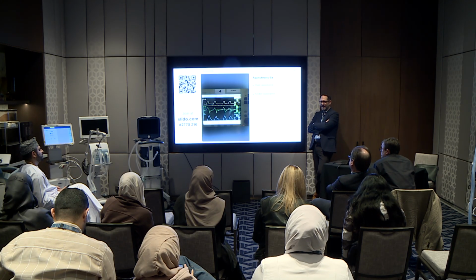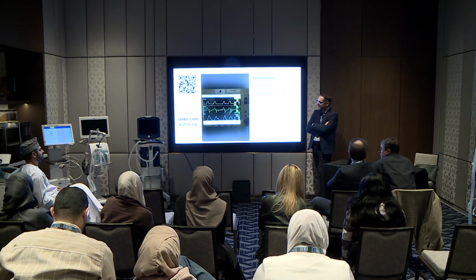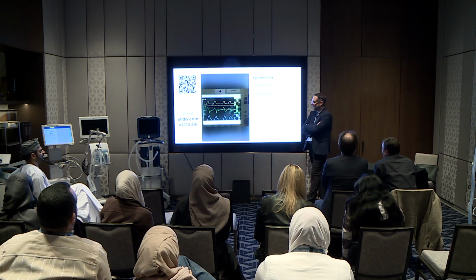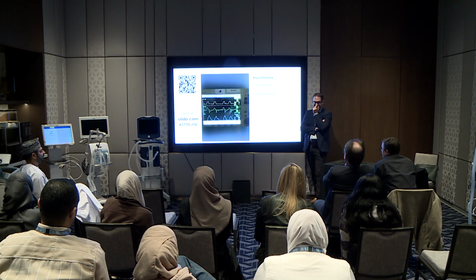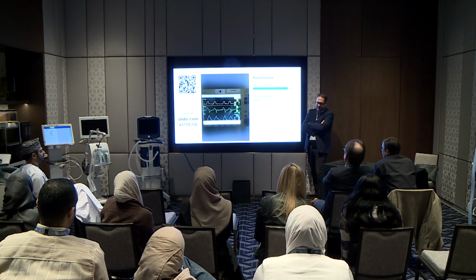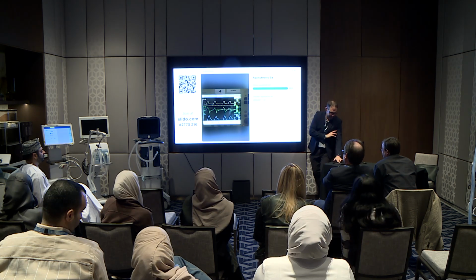The person seems asleep and unaware, seems comfortable. You can see some clear, strange things on the waveform there. I'm actually going to point out something interesting with this picture once we discuss it. Over assistance is correct.